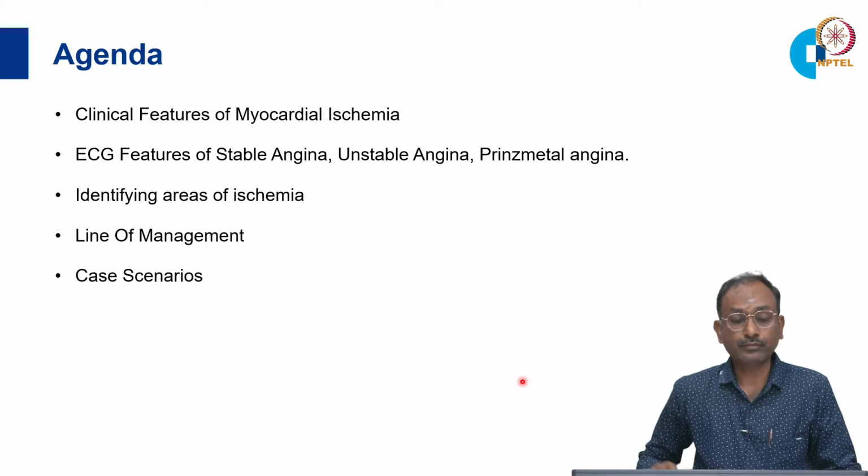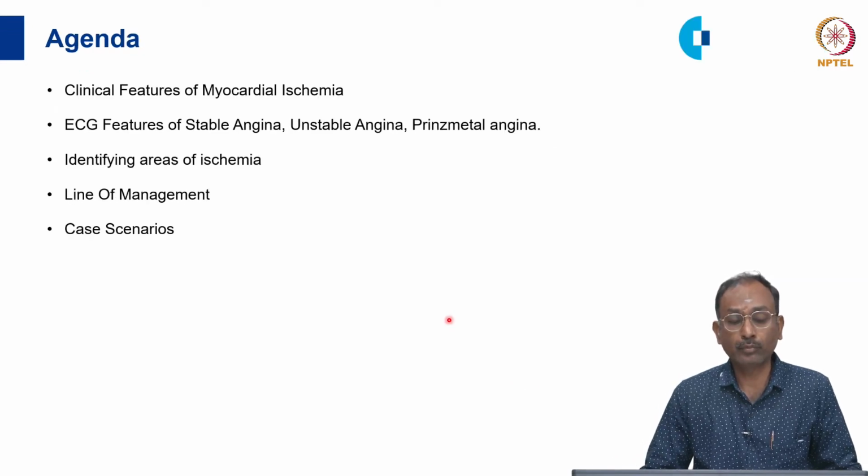The agenda of this presentation: first, I will be discussing the clinical features of myocardial ischemia, followed by ECG features of stable angina, unstable angina, and Prinzmetal angina, then how to identify the areas of ischemia, then a few words about the line of management and the case scenarios.